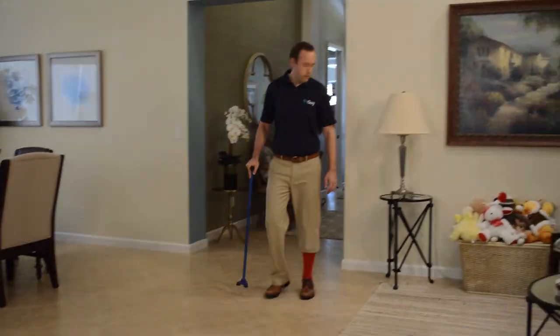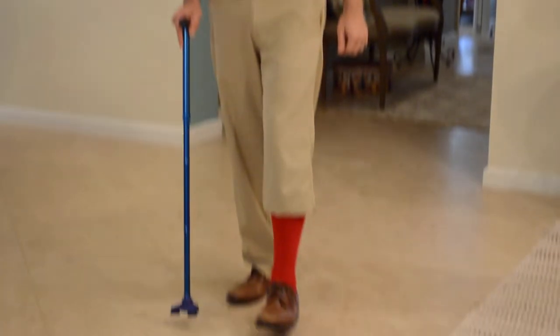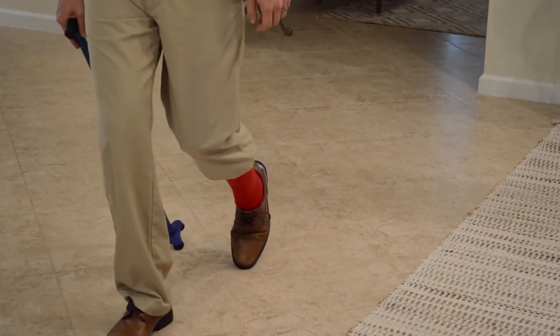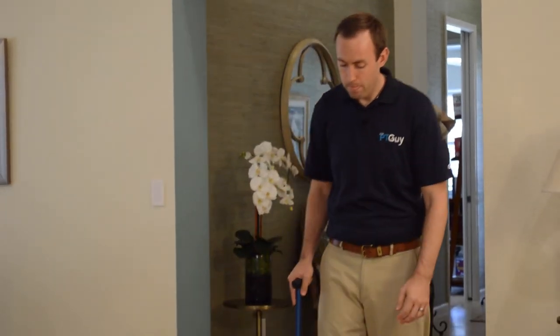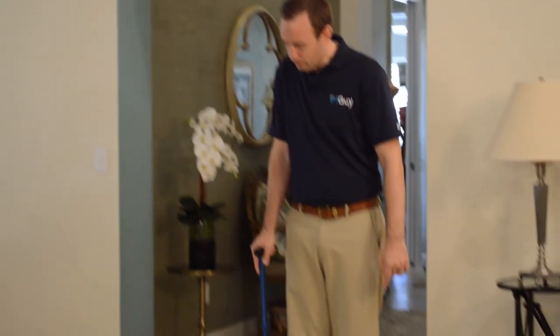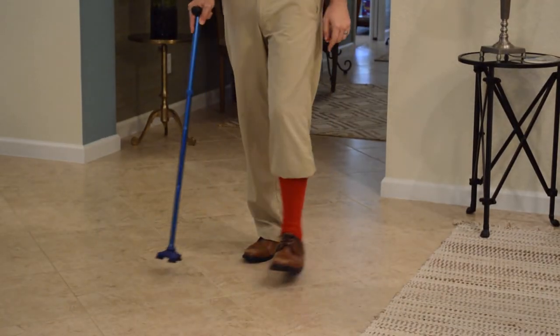Canes can be very dangerous if you place the cane in the wrong spot. If I place my cane a little bit too inside when I'm taking my step, my other foot can catch it and I can trip. You need to be very careful where you place the cane. I like to keep my wrist cocked a little bit — that way I know the cane is outside of my other foot.